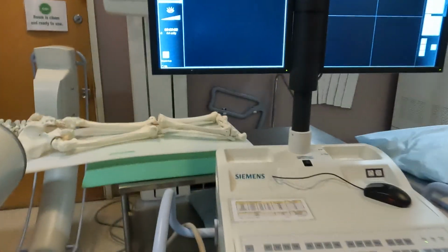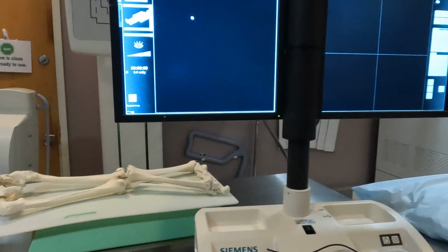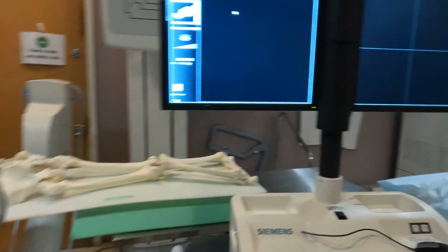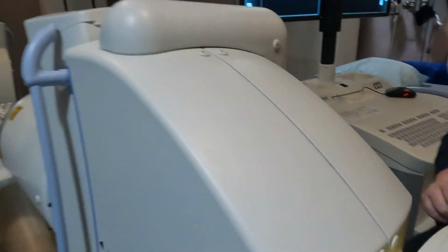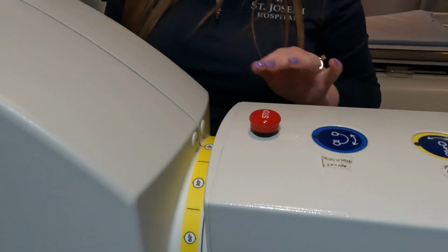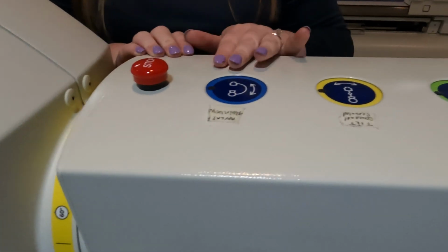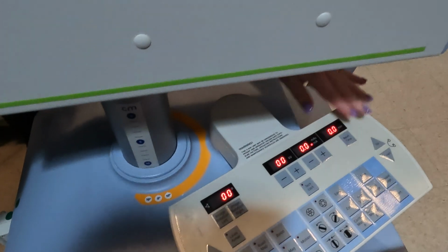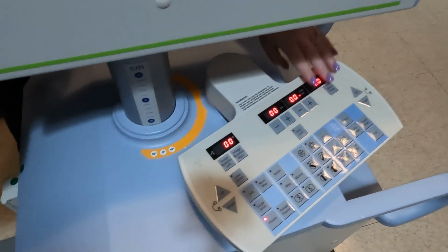So now your surgeon, after taking some AP and lateral images, asks for you to do the spin. The first thing you're going to do is actually take an AP and lateral image with the C-arm to make sure that you're in a good spot. So the best thing to note when you're doing this is the only button you can use is this button and up and down. If you touch anything else, it could ruin your spin.